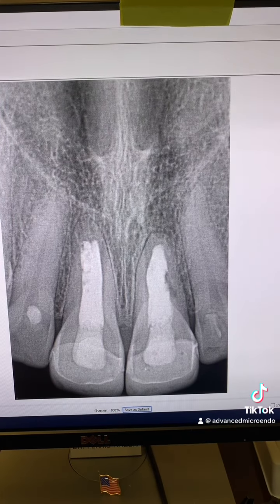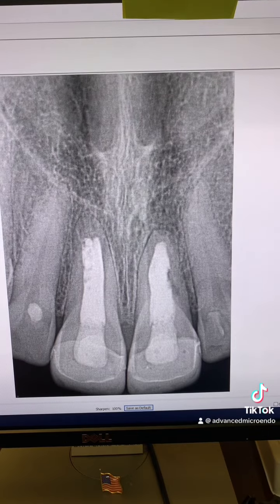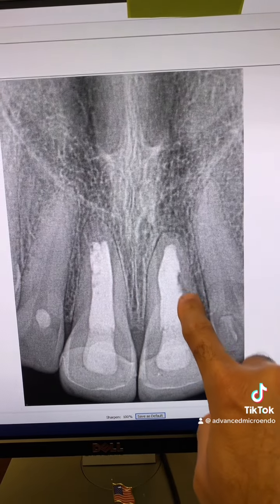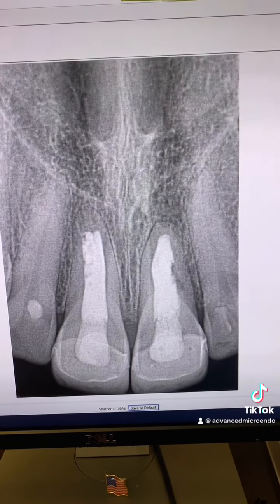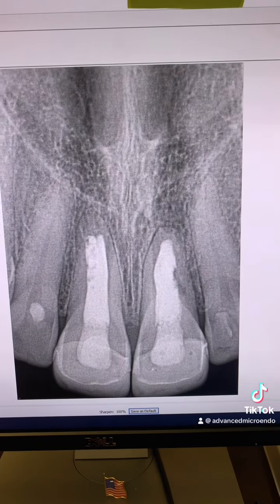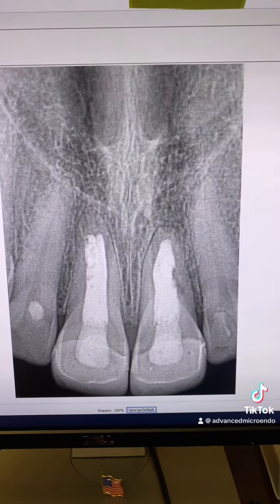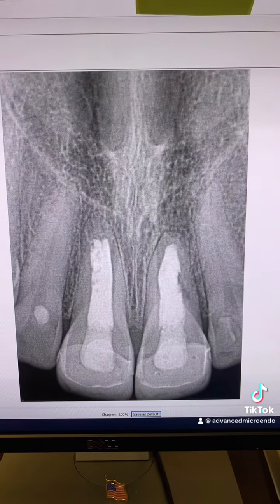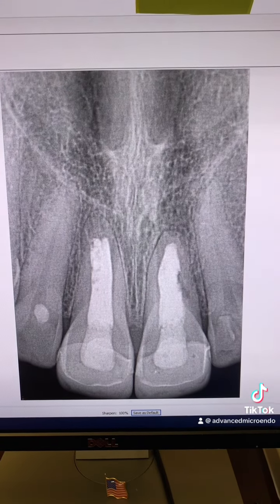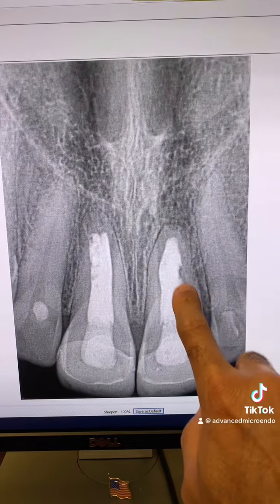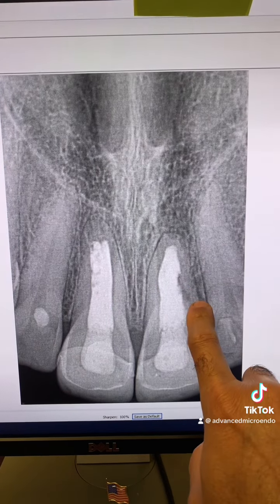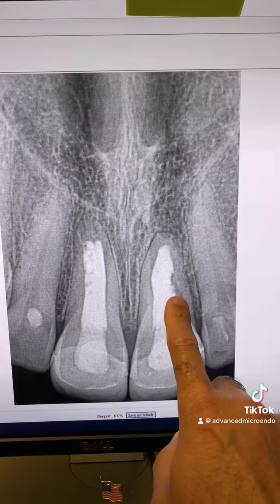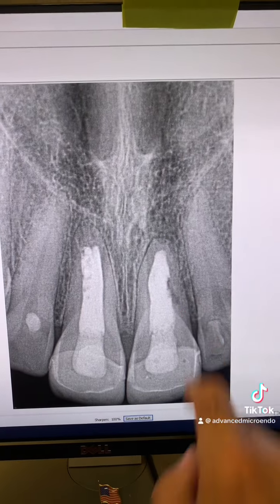I got a few correct responses. Take a look here — right there you can see that is inflammatory root resorption. As you should know, the likelihood of it happening is high when it comes to traumatized teeth, so you need to discuss that with the patient before you do anything. That's what's going on here: secondary infection due to that inflammatory root resorption. And you can see the bony changes right there as well.